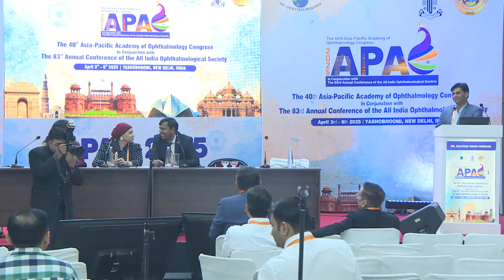It was deficient, probably yes. The inferior part is locked with the iris and all fused, so it is not quite stable because of that. But the stability of the lens, and any vitreous, if it is present, should be cleaned before. And you have already done very beautifully on the management of the iris. The cataract should be managed, with removal of all the lens matter. And you have managed visual access right in the first surgery. That is a good thing which you have done.